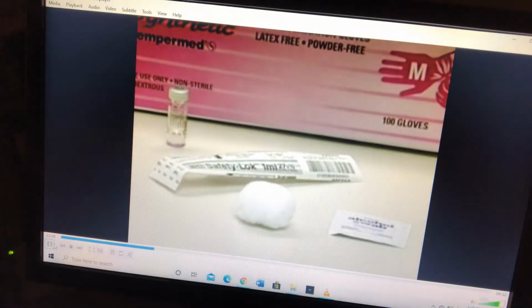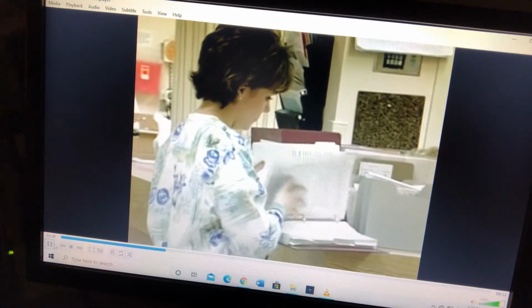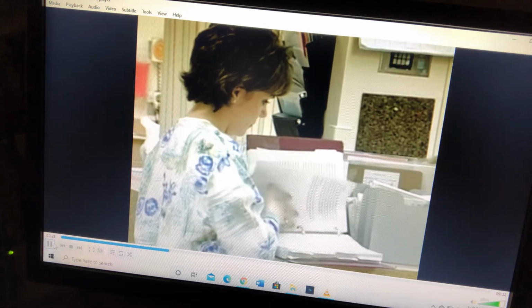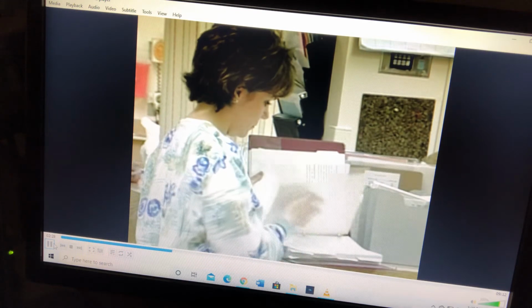Supplies necessary for an intradermal injection include needle and syringe, alcohol pad, cotton ball, gloves, and appropriate medication or agent. Some agencies may not recommend cleaning the site with alcohol prior to giving an intradermal injection. Test results could be affected by improper alcohol use. Be sure to check agency policy and procedure.